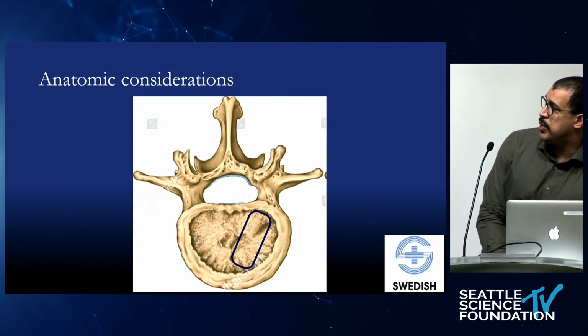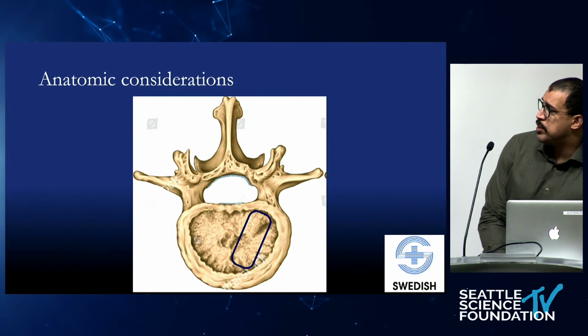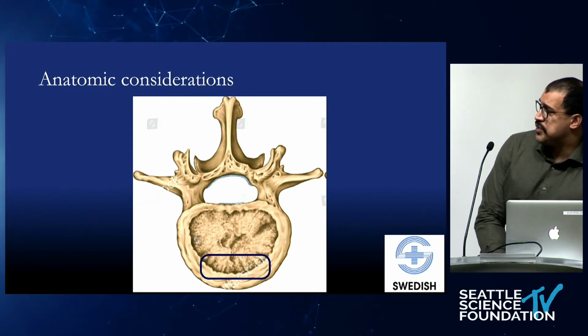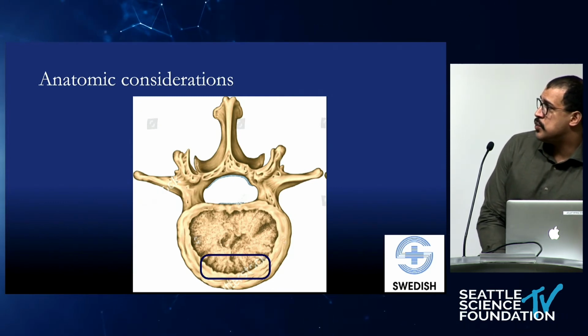Just some things that I've noticed, and obviously we all have injuries to the end plate. That's the softest bone there in the center of the vertebral body in a traditional straight ahead TLIF approach. So if it is damaged, you may want to switch to more of a banana type cage that's going to put it forward onto the apophyseal ring. You don't even need to come to the other side. You can just change your implant and get a much better purchase on the bone. And I think that's something that you can do intraoperatively to salvage one of these if you do find that you've violated the end plates.